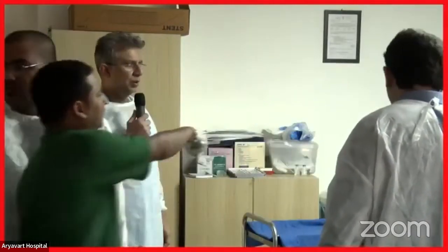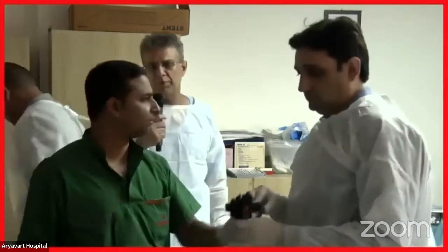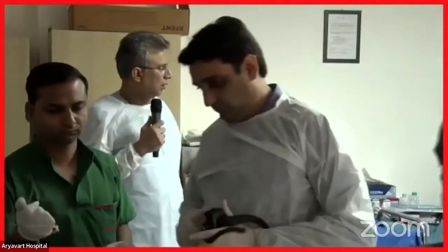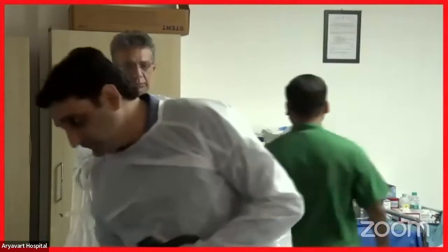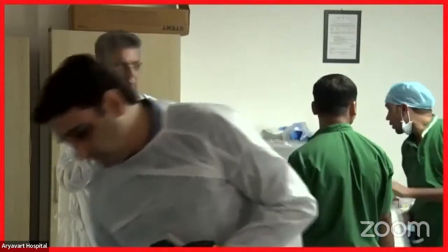Shark core. Yes, okay. Yes, 22 gauge shark core, or 19G Pro core. So he prefers the Pro core. He prefers the 19G Pro core needle of Wilson Cook. So the needle is finalized. He's going to use 19 gauge.